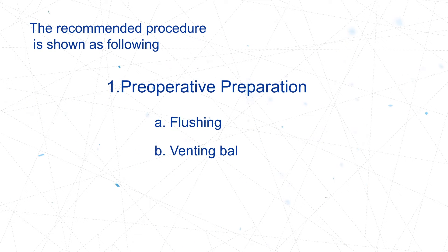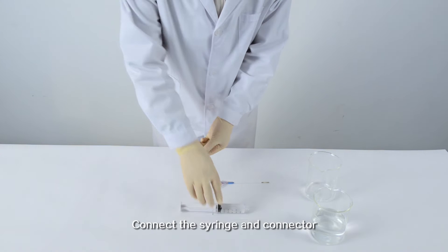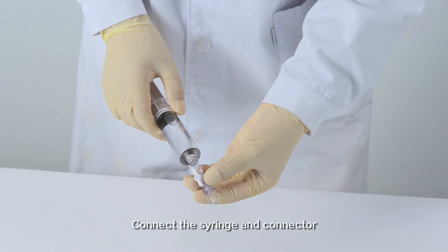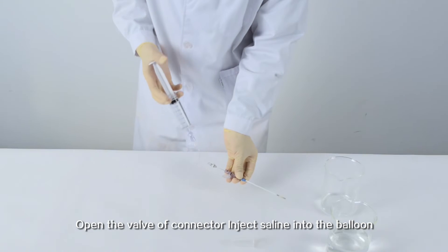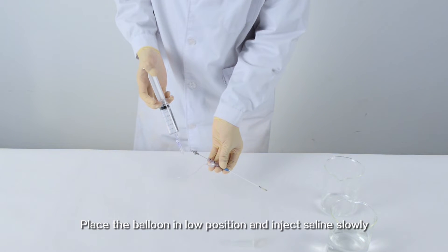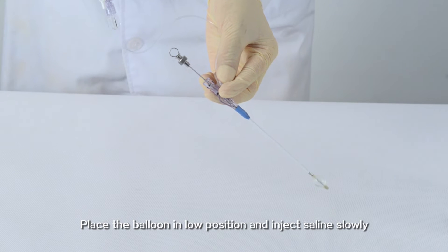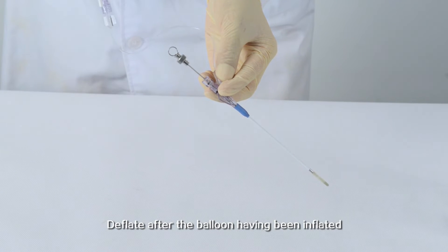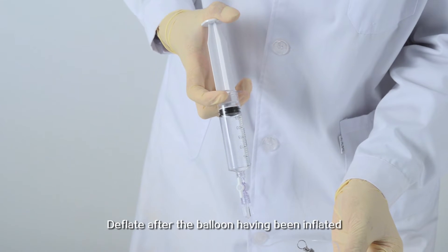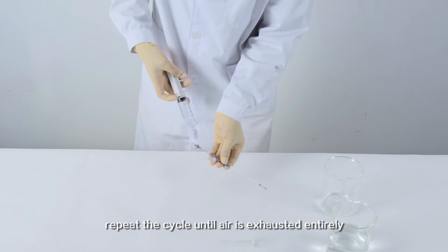Venting the balloon: Connect the syringe and connector, then open the valve of the connector. Inject saline into the balloon — place the balloon in a low position and inject saline slowly. Deflate after the balloon has been inflated, then repeat the cycle until air is exhausted entirely.